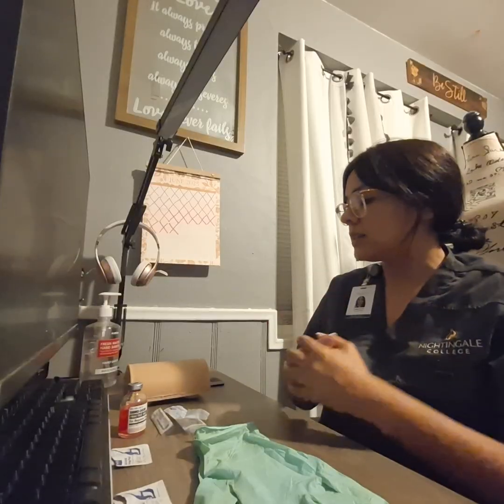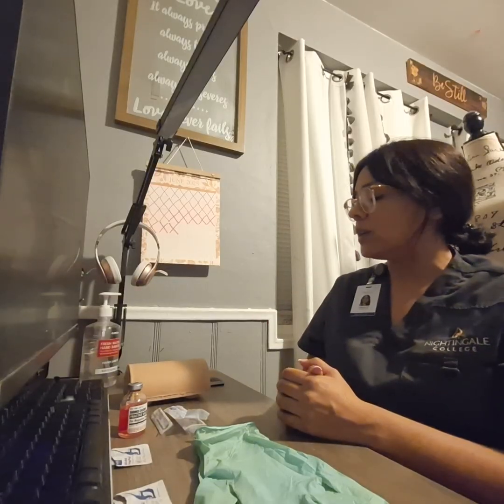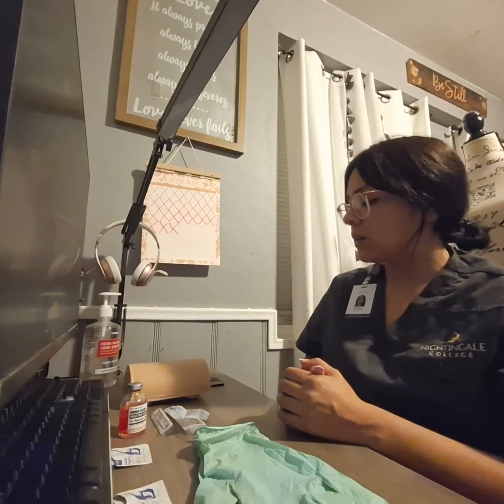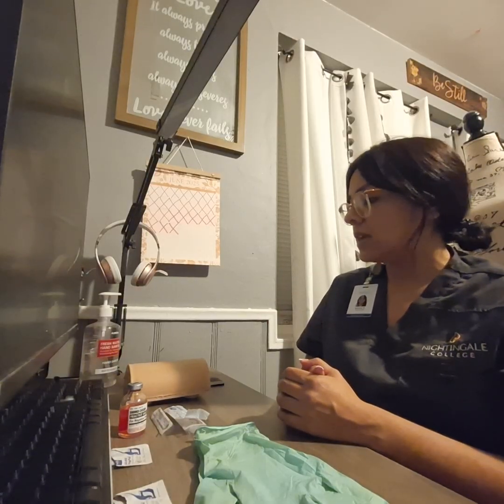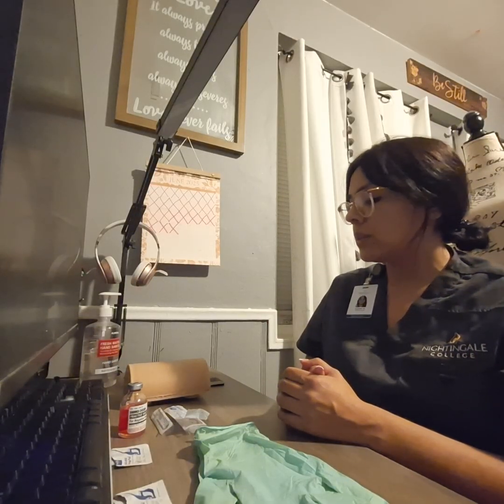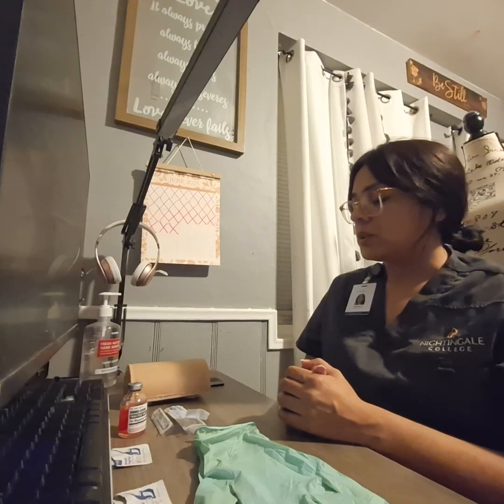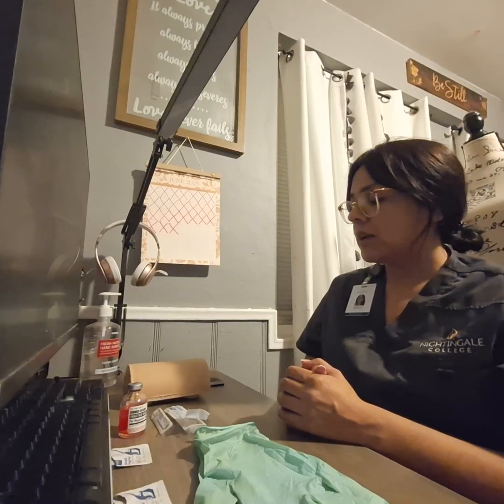Hi, Mrs. Garcia. My name is Stephanie and I will be your nurse today. Can you please verify your first name, last name, and date of birth? I went ahead and verified with two patient identifiers.